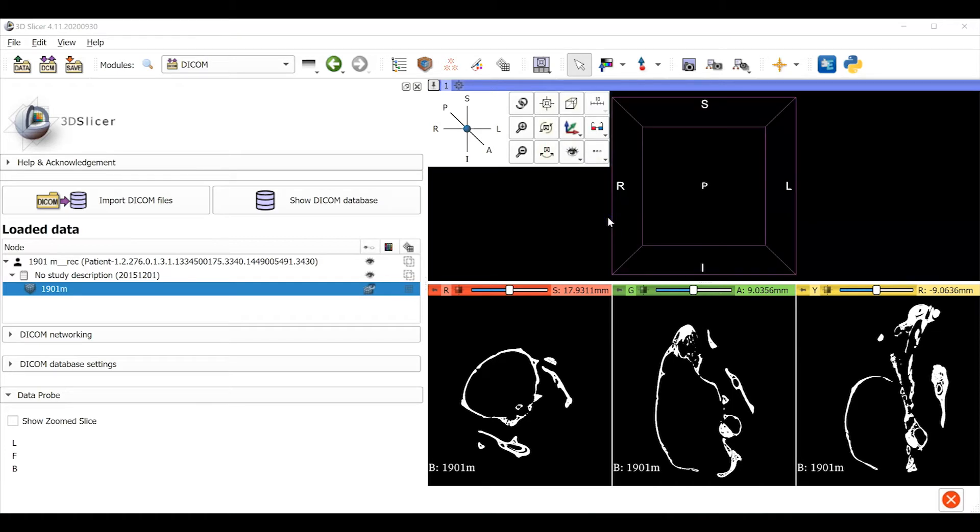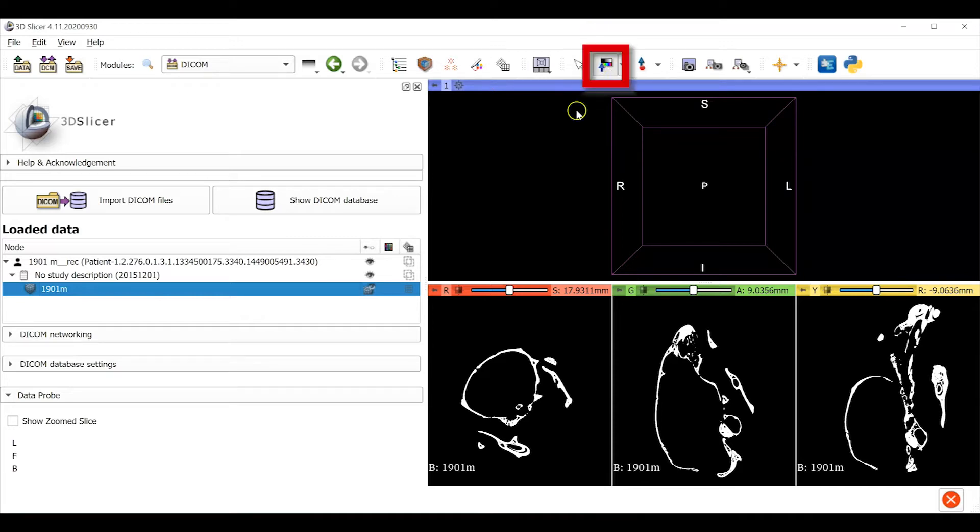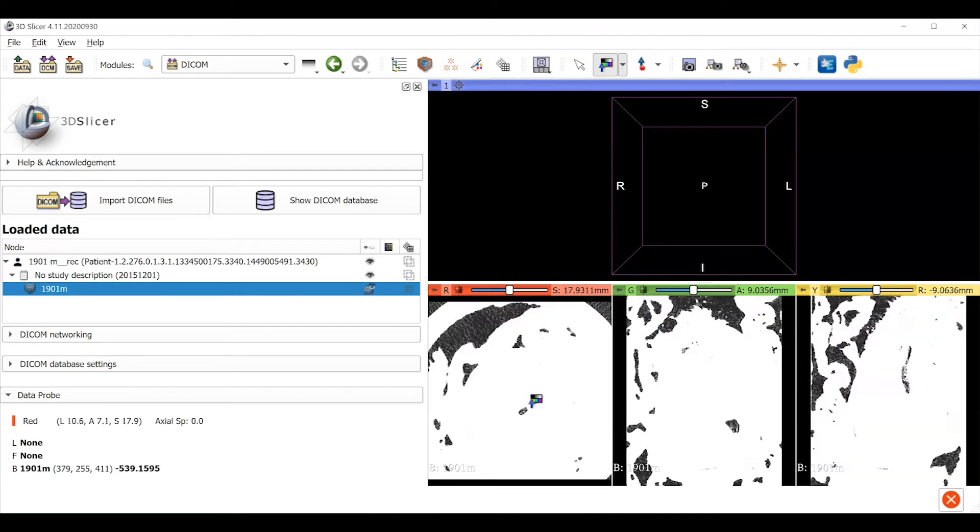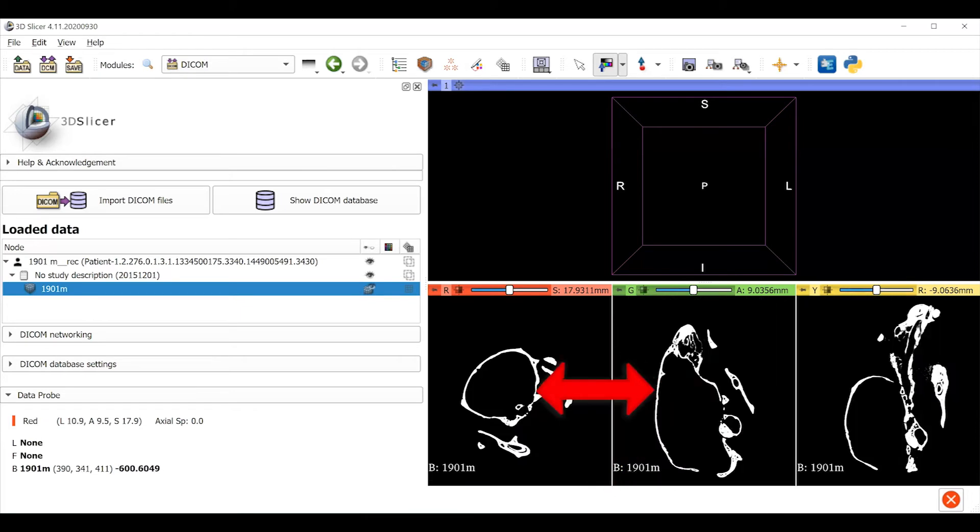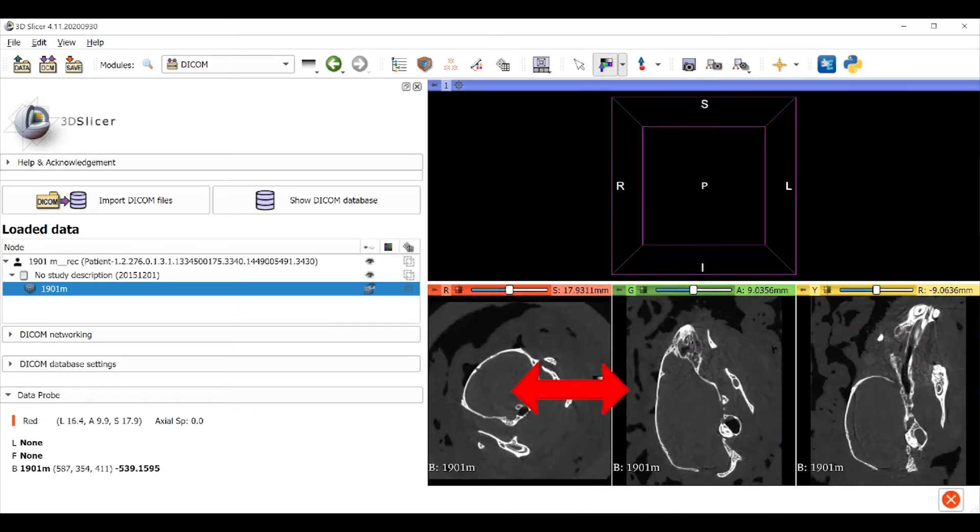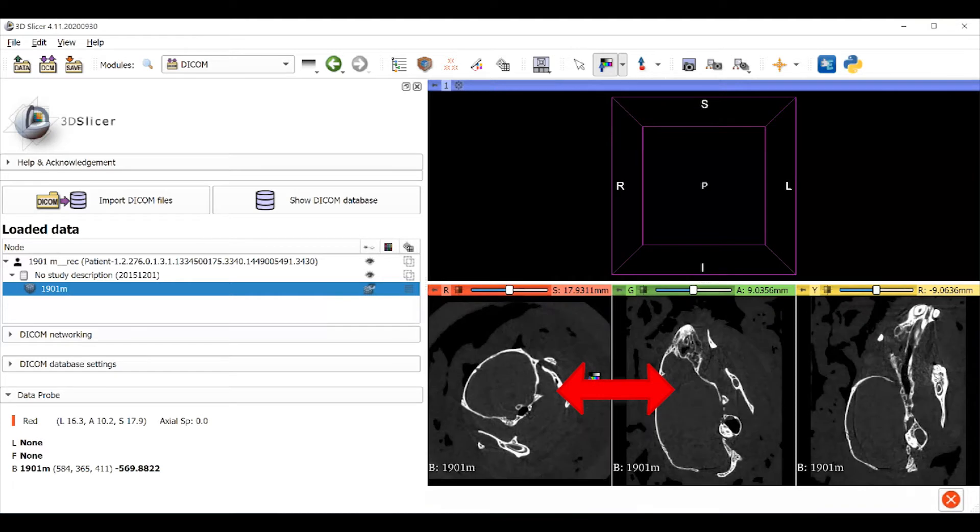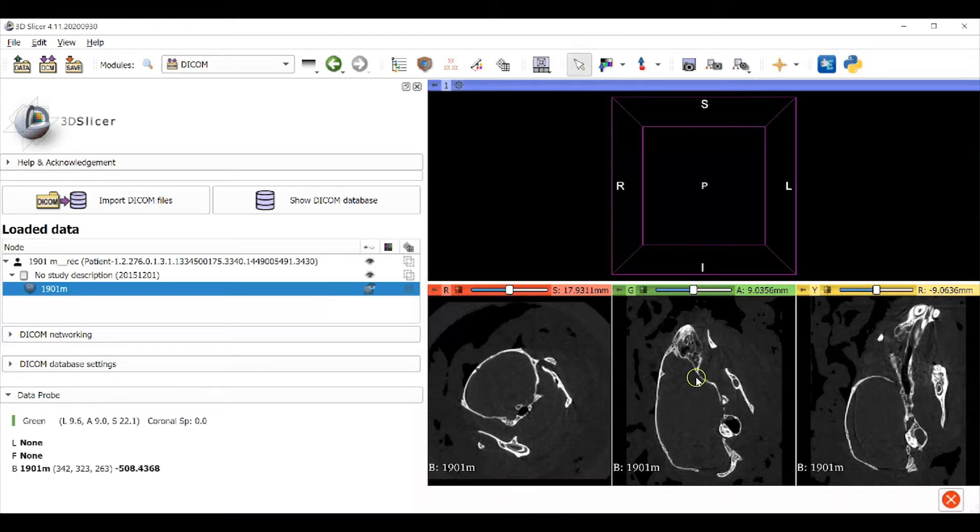The bottom three images in this view are 2D slices through the volume. The images are super high contrast and it's hard to pick out some details. We want to adjust the grayscale values using this tool in the top menu. This grayscale tool acts as a dragger when you click in one of the views. Up and down movements adjust the brightness, and side to side movements adjust the amount of contrast. Our goal is to be able to see the thin bone inside the skull. Click the white arrow back in the top menu to release the grayscale tool.